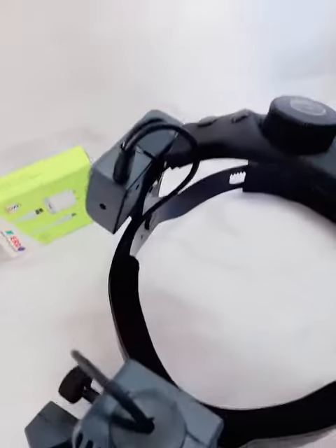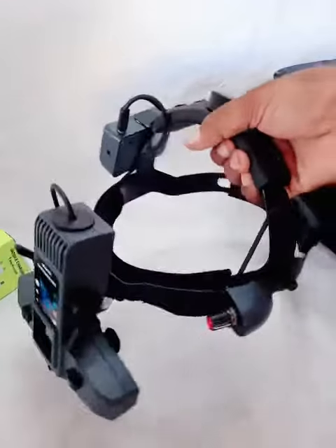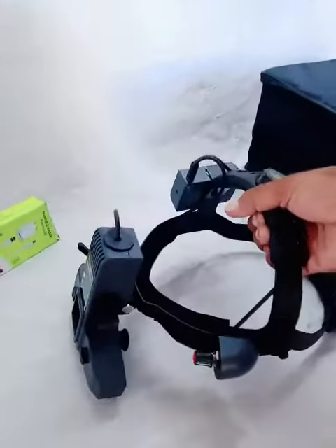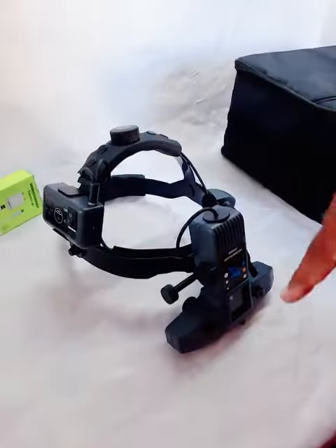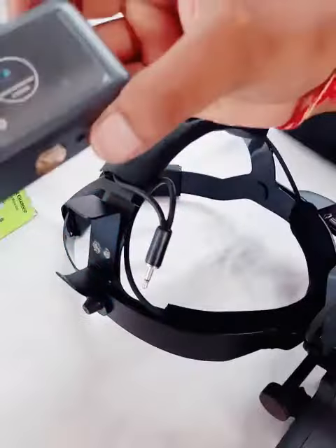You can see this is the removable battery set. Do you see it in there?